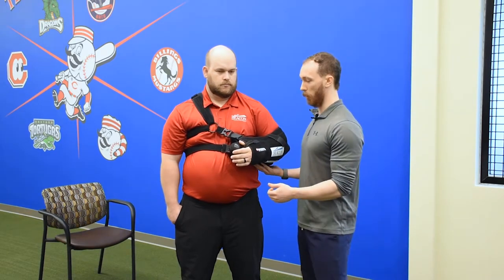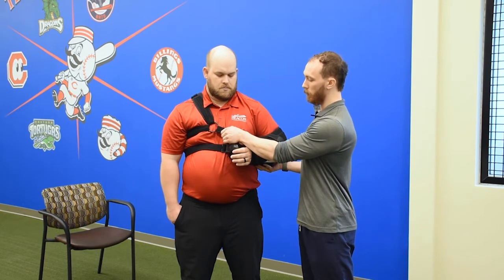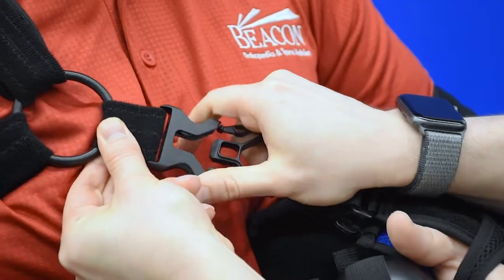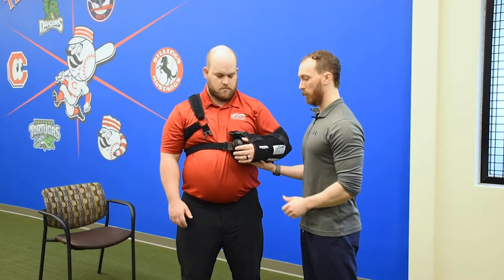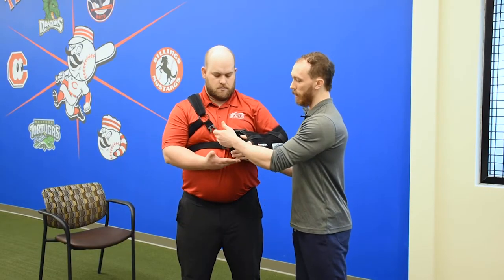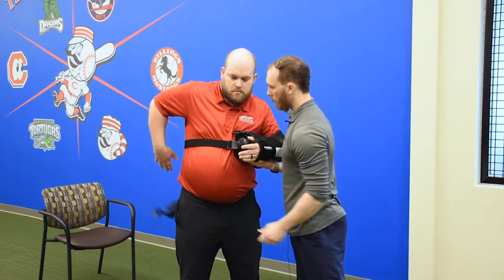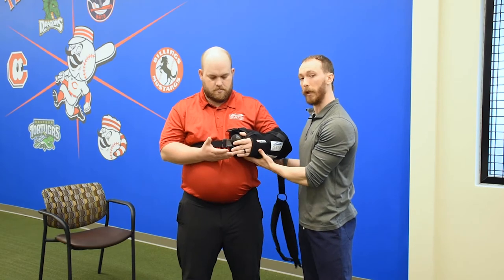To start, we have a quick release buckle right in the front here. If we squeeze that on both ends, it's going to unclip it. Then you want to support this arm, or the affected arm, and then we're going to slide this down. It's just going to come off like you would take off a jacket.